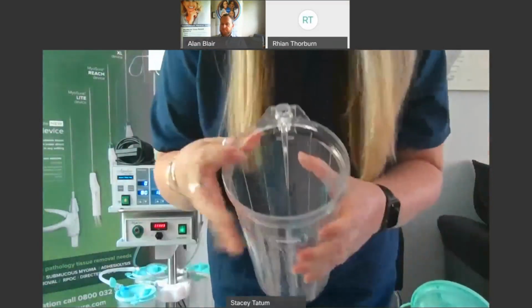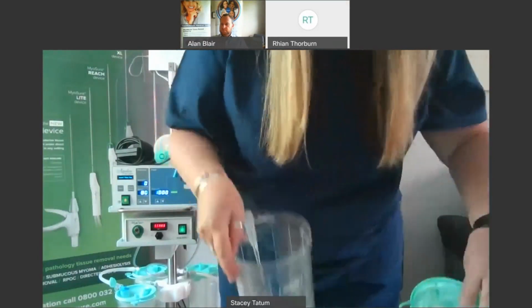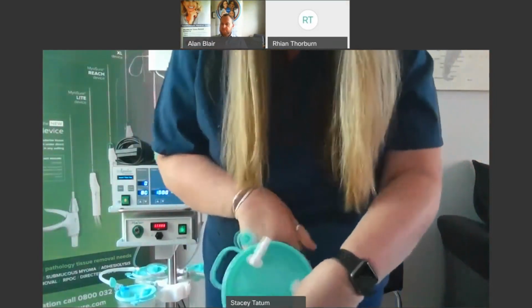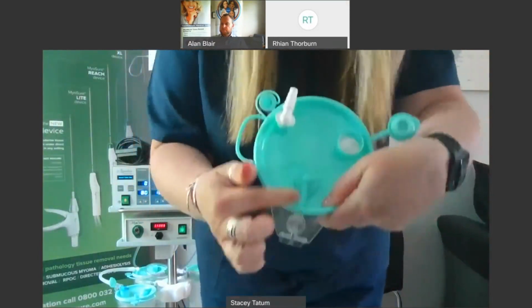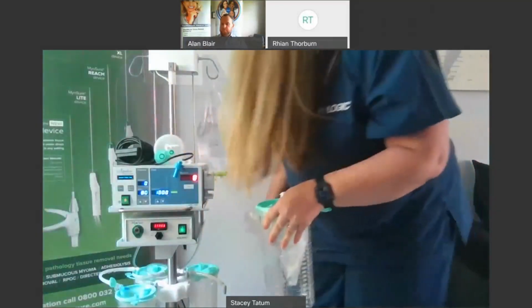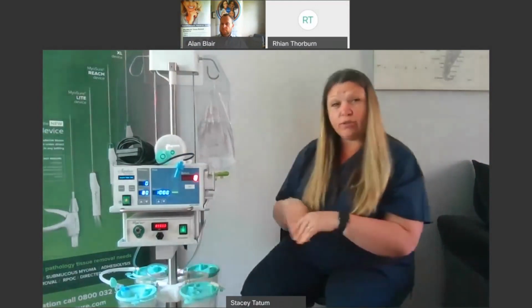Each rigid canister also has a hole in it, and that is indicated by the larger hole on the outside of the canister. So when you are putting these together, you need to line up the holes together. So in goes the liner. I've lined up the end of the lollipop with the outside, and then I seal it down nice and tight. It's best to do that off of the scale.